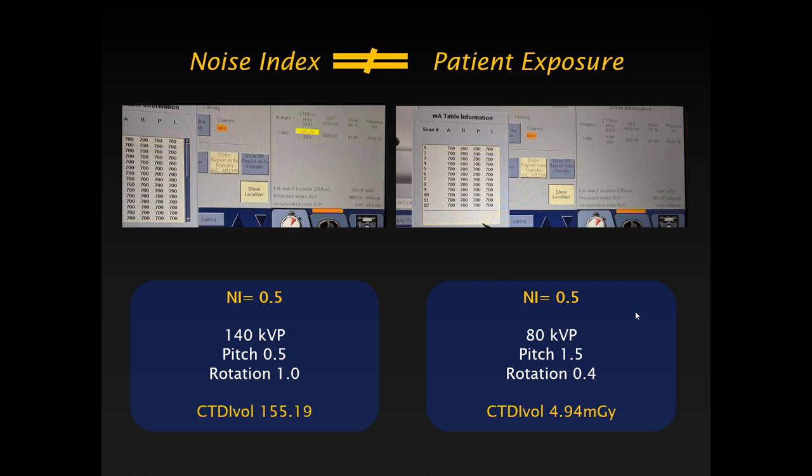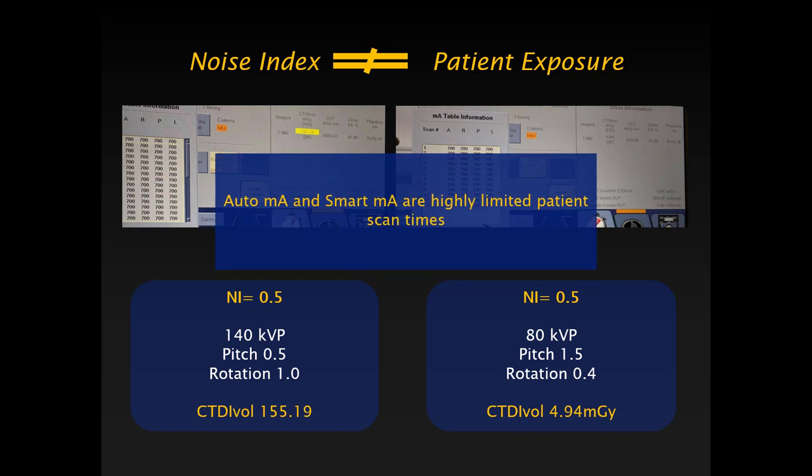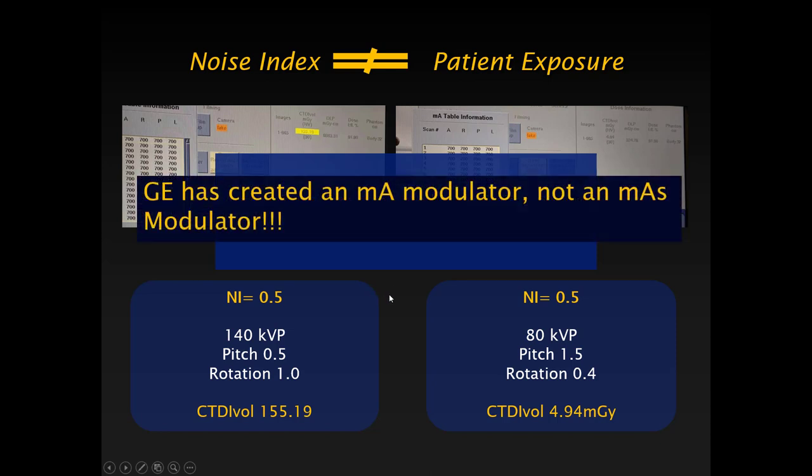It's not automatic. It's not SmartMA. It's an MA modulator, okay? These are limited by scan times. If your scan times are not accurate, your modulation system will not work correctly. It's an MA modulator, not a time modulator, not an mAs modulator.